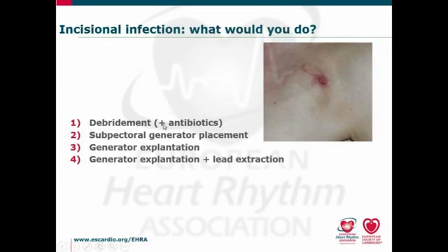Would you clean up the wound, debridement plus antibiotics? Would you place the generator subpectoral? Would you explant the generator and leave the leads in and reimplant? Or would you take the whole system out? So again, can we vote, please?